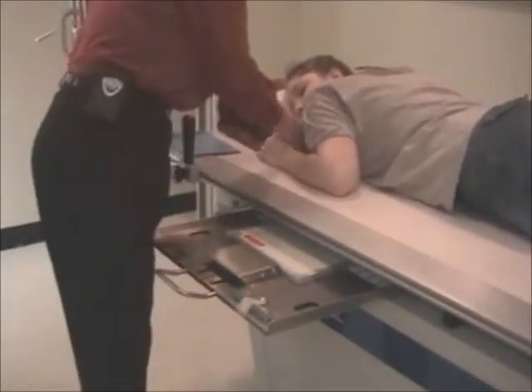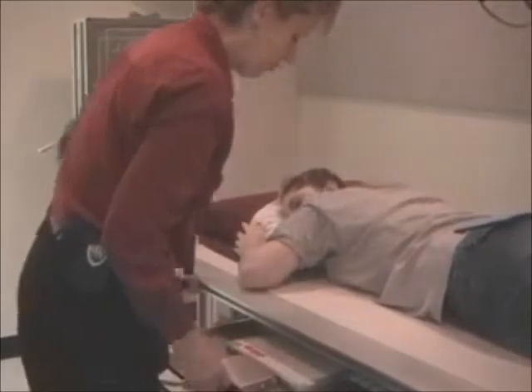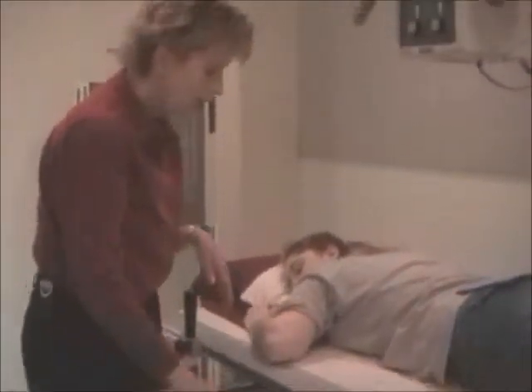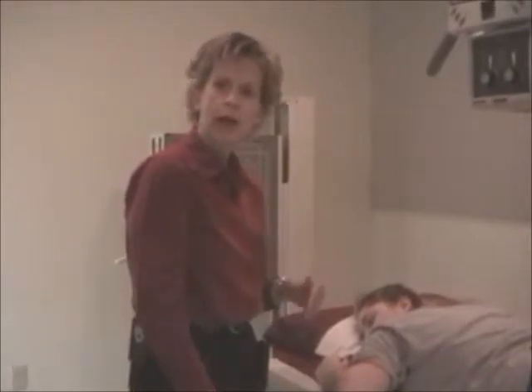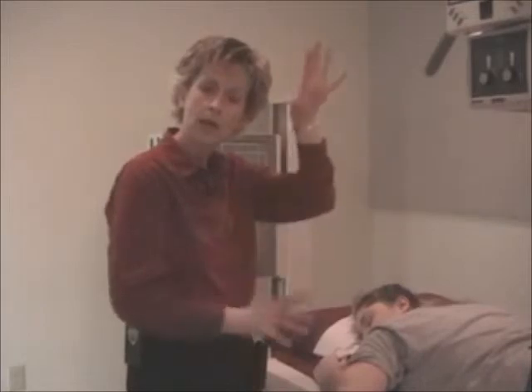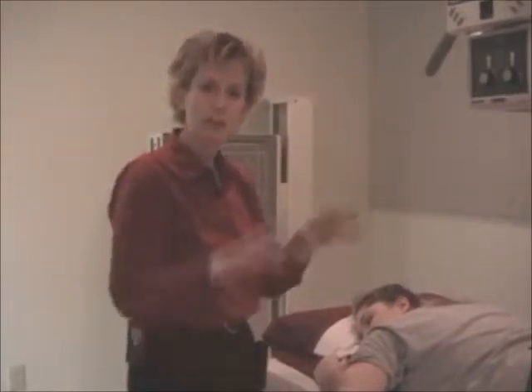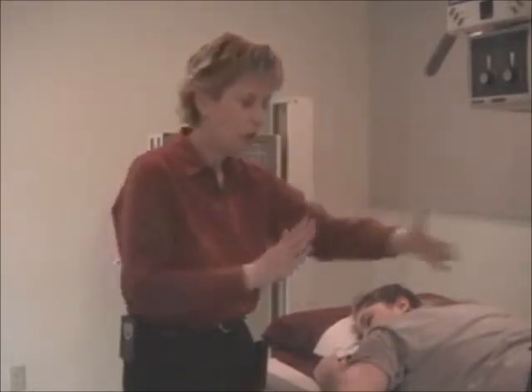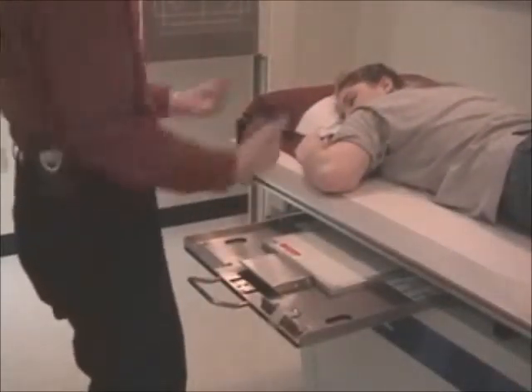And they're going to go into a PA position. Both arms up, both arms down. And I'm going to a crosswise mode because the stomach, when you're in an oblique or a lateral position, tends to elongate. So the film goes lengthwise. When the patient is in an AP or a PA position, the stomach tends to go more transverse. So we want the 12-inch axis to be wider across the body. And I'm putting the ID blocker towards you, towards the tech.